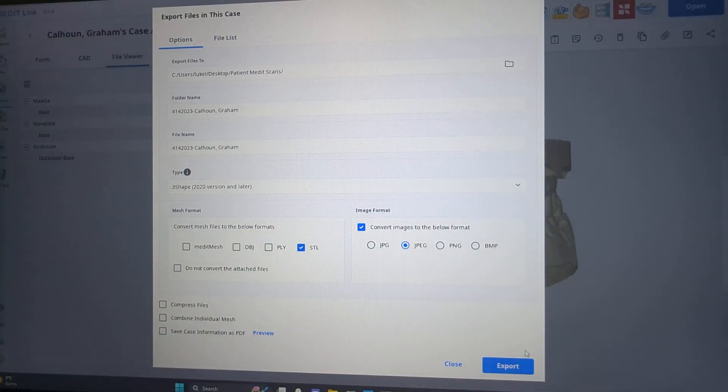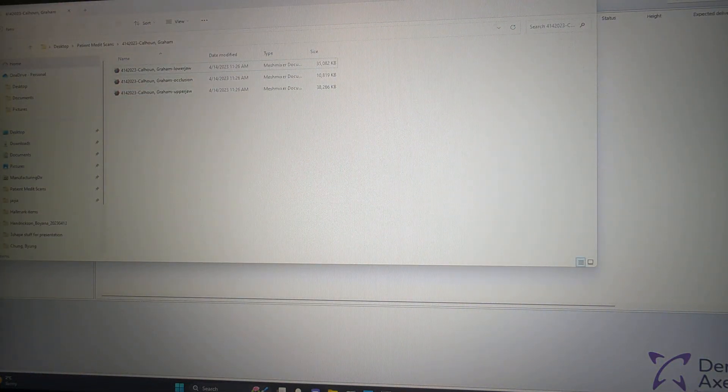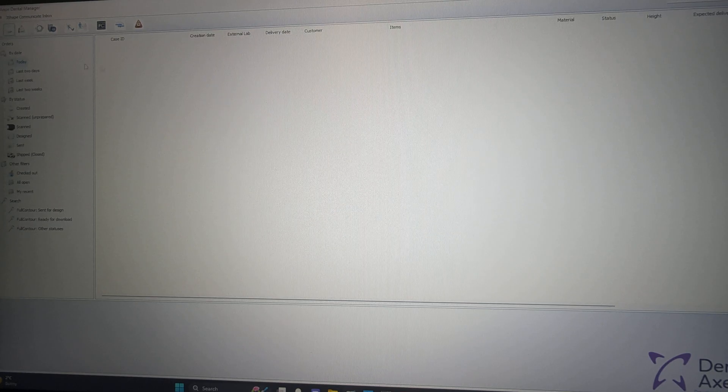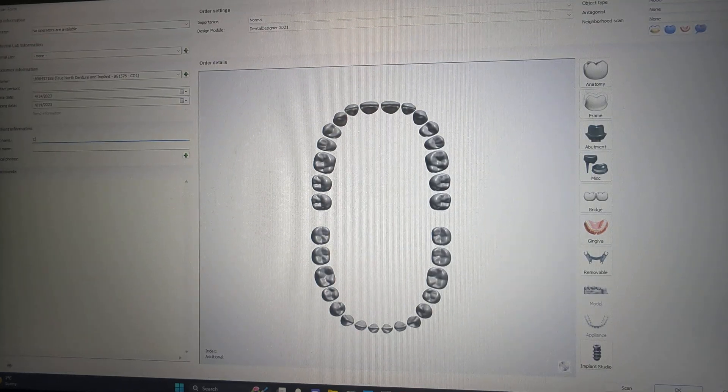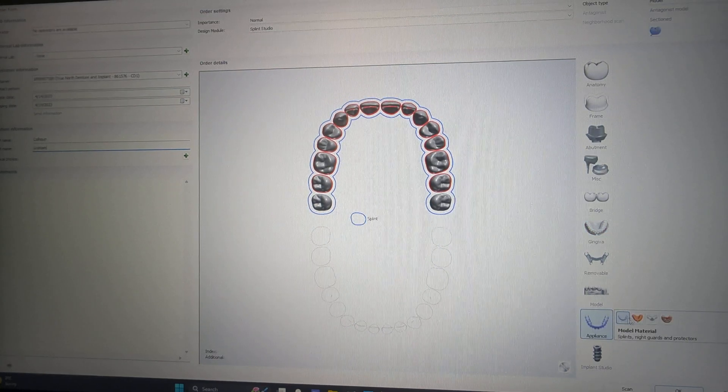We received the models and scanned them into Medit and have created the files. Here we are going to create — put the name in and we select the upper arch. This is for an upper night guard.